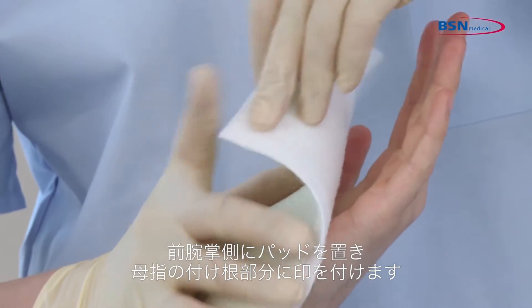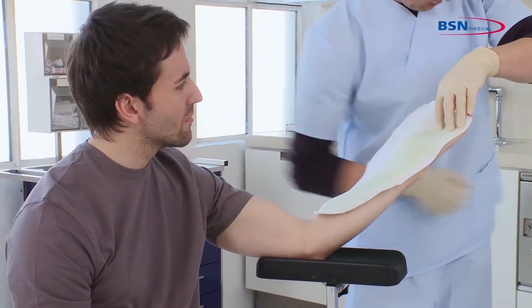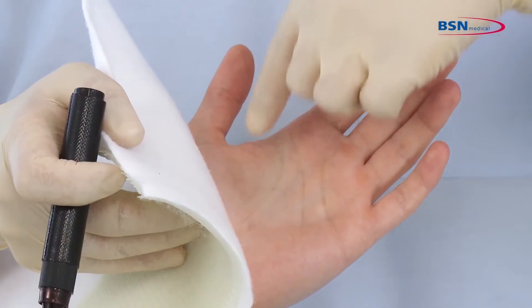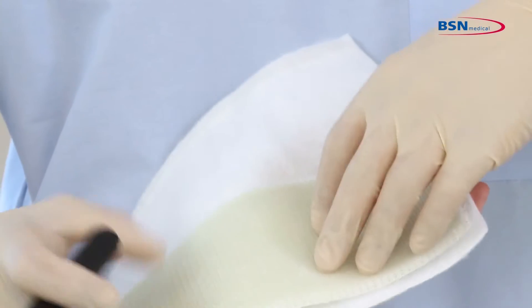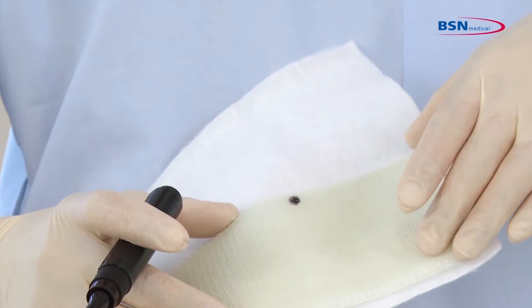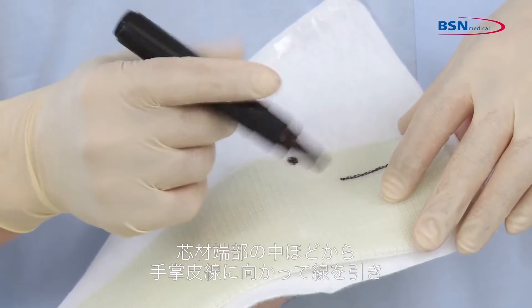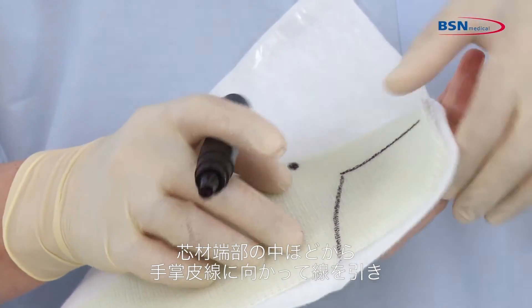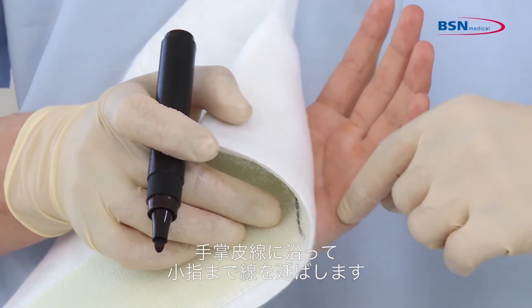Place the padding on the patient's volar arm and pinch the substrate at the web space of the thumb. For an easy custom-made splint, mark a line from the middle of the substrate to the palmar crease, and follow the palmar crease towards the smallest finger.